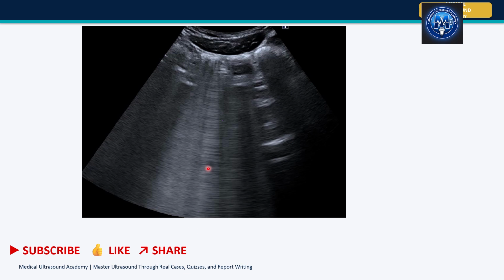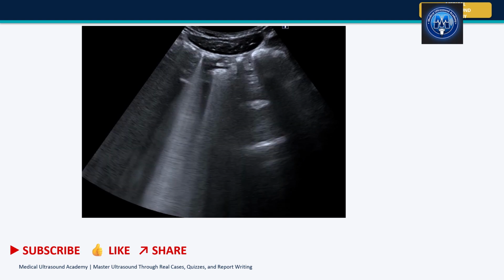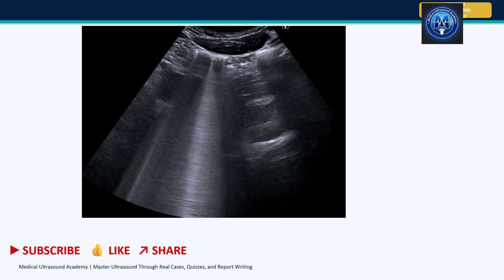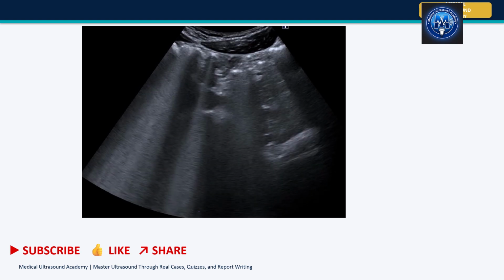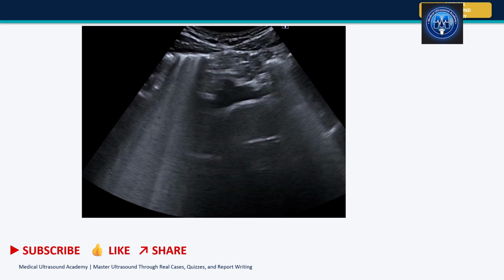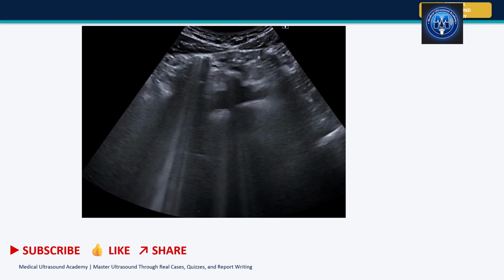So this is concisely how bowel gas appears on ultrasound. I hope you will not miss about gas, or you stop wondering how gas looks, or if someone is just joining us for the first time today, you can now appreciate how bowel gas appears.